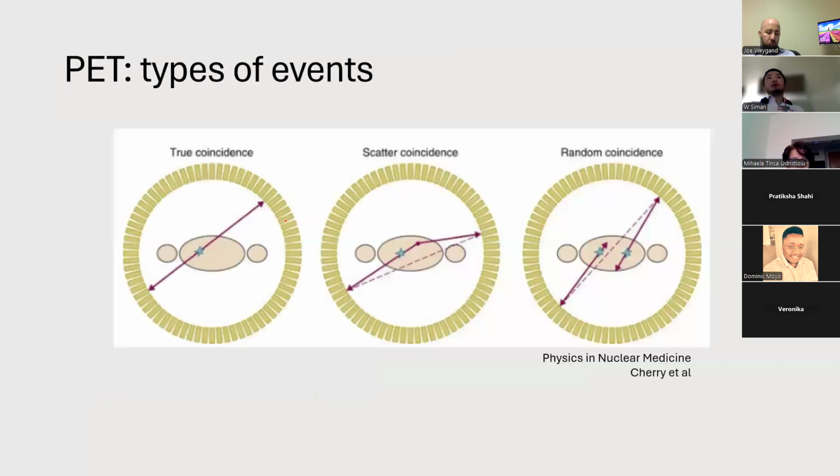So what types of coincidence do we have? One is true coincidence. Annihilation happened here, you detect one event, two events, beautiful. You get your line of response over there, and it's a correct one. That's what you want.